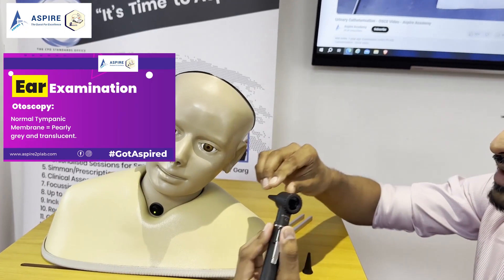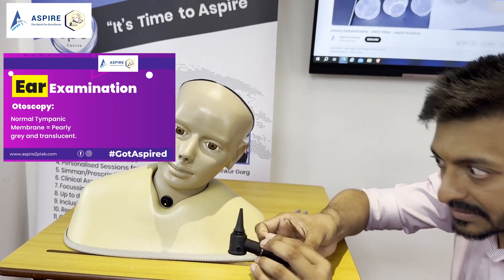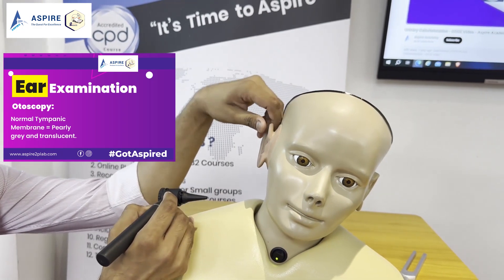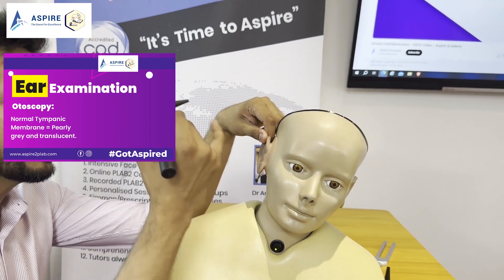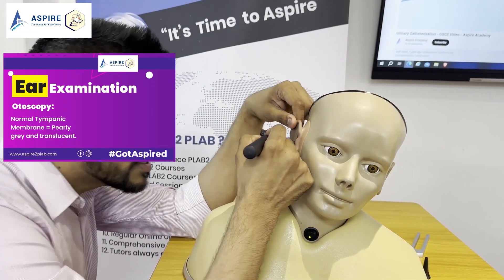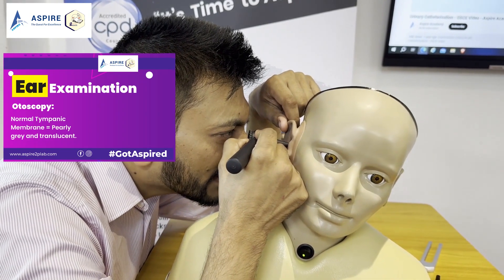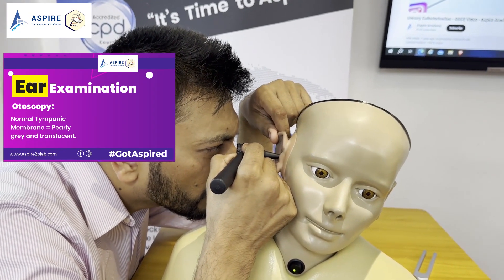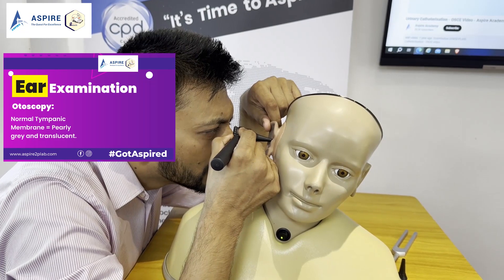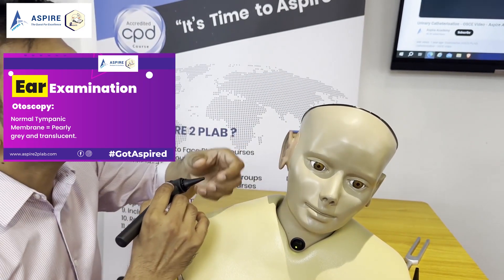Before you go to the next ear, make sure you change the earpiece. Put on the new earpiece and go to the other side. Pull the pinna upward and backward, holding the otoscope like a pen with your little finger on the patient's cheek, insert the otoscope, and verbalize your findings. In a normal tympanic membrane, you will note: it is pearly gray in color, you can see the umbo, cone of light, pars tensa, pars flaccida is visible, and the annulus is visible as well. So most probably it is a normal tympanic membrane.